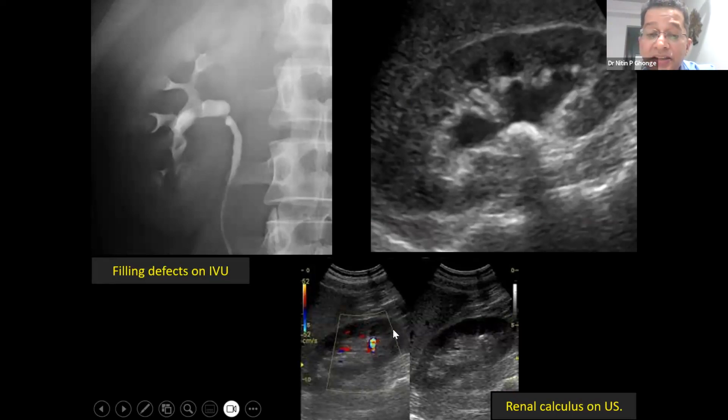Very important that the ultrasound diagnosis of calculus is very, very observer dependent. Like caliceal calculi of 4 mm, 5 mm may be wrongly measured or may be missed on ultrasound. So it is important for the observer to be very objective in terms of technical settings to decide whether the calculus is really there or it is an artifactual echogenicity because of the technical factors, because of the multiple interfaces.